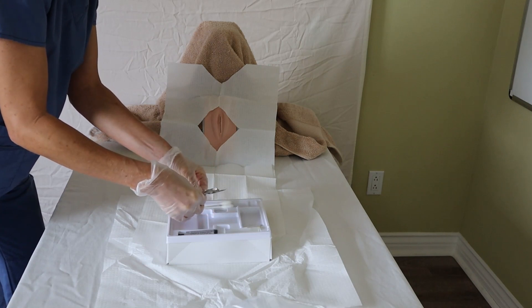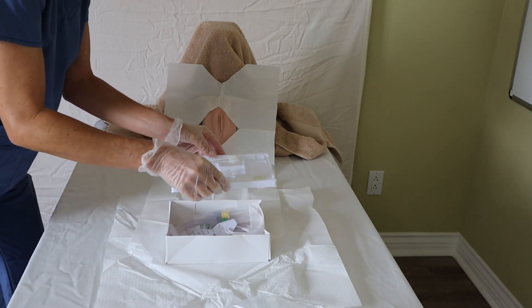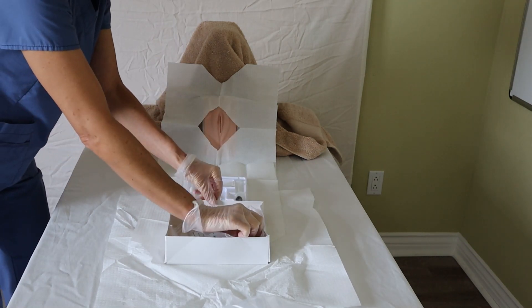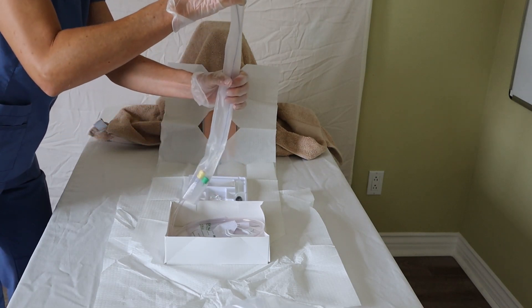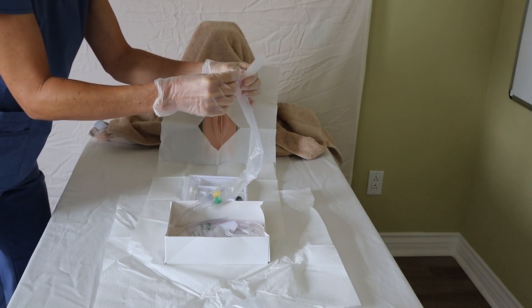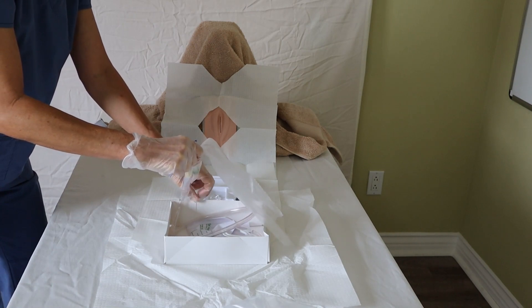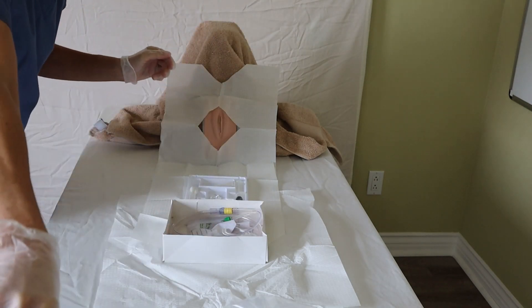I squeeze the lubricant into the catheterization tray and then take out the tray, giving me a nice lane again. In this kit I have the actual catheter, which comes nicely curled up and wrapped in plastic. This tends to want to fling around, so it's best to hold it at the tip and slide it out, or since it's perforated, you can open up the perforation and let the catheter be unwrapped. I pay attention to my wrapper so it doesn't touch anything outside the sterile field.